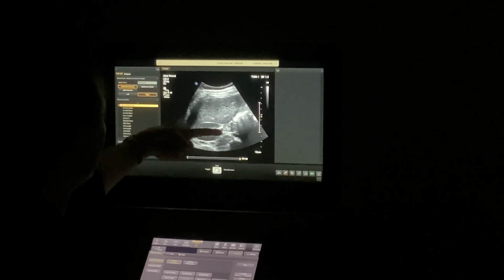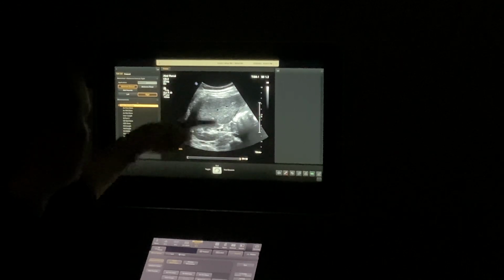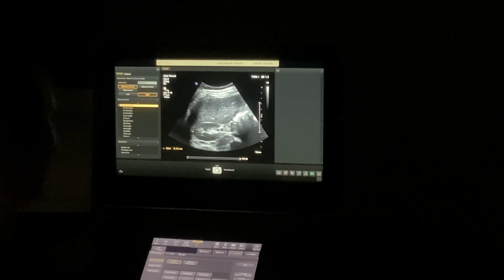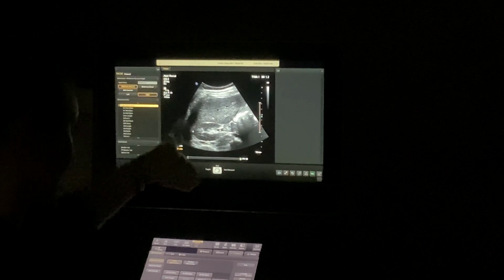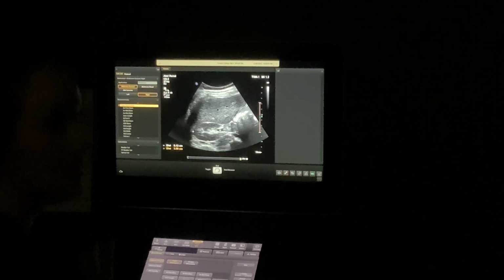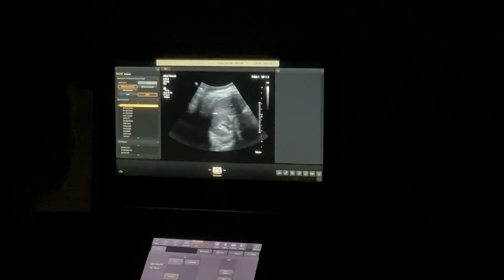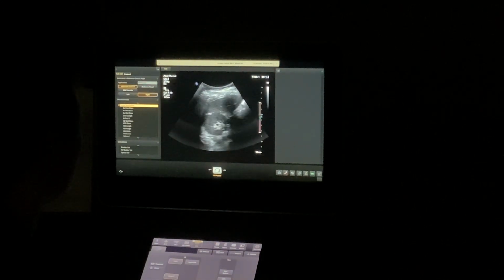So if I had that right here, do you see that completely cuts my kidney in half, right? Evenly each side. That's where you want your calipers to fall, when you've got it nice and perpendicular like that, okay? Now if we were doing our height measurement here like we have it on your protocol, here and here, because again, I'm perfectly perpendicular on the screen, that is an AP measurement, okay? Does everybody see this and understand it? Okay. So that will be your mid, and you'll do mid with and without the measurements, and then you'll do it with and without the color.